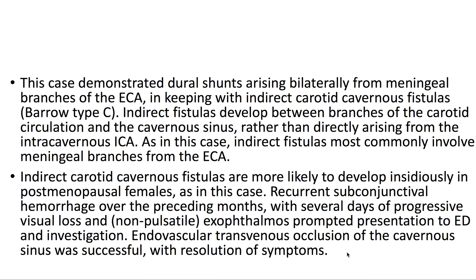This case demonstrated dural shunts arising bilaterally from meningeal branches of the ECA, in keeping with indirect carotid cavernous fistulas. Indirect fistulas develop between branches of the carotid circulation and the cavernous sinus, rather than directly arising from the intra-cavernous ICA. As in this case, indirect fistulas most commonly involve meningeal branches from the ECA.